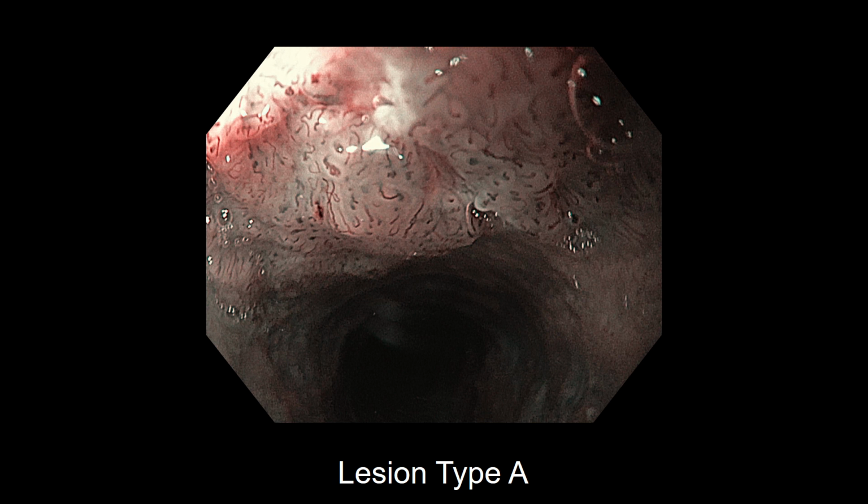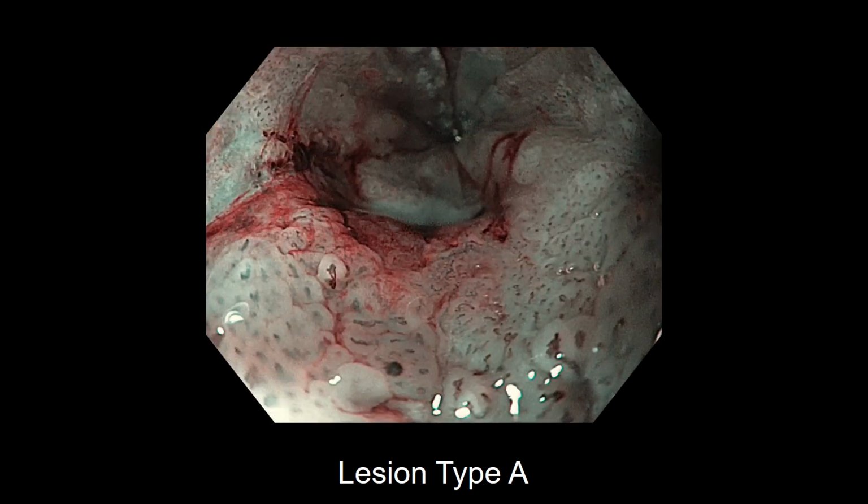Yes, in this image the surface has ups and downs, so we suspect a deeper lesion. When I check the vessels, they still keep the loop shape but stretched. That means the tumor, compared to the previous image, has more thickness, but is still mucosal. We don't find any extra large vessel or exposure of the neoplastic tissue. Okay, thank you.